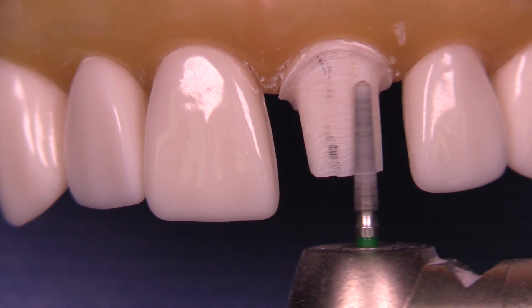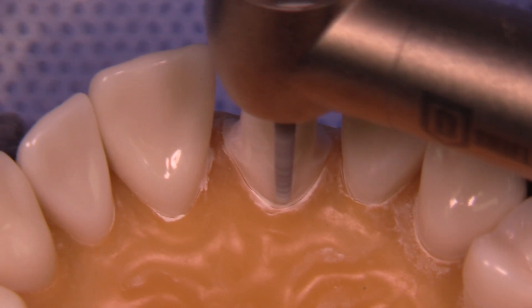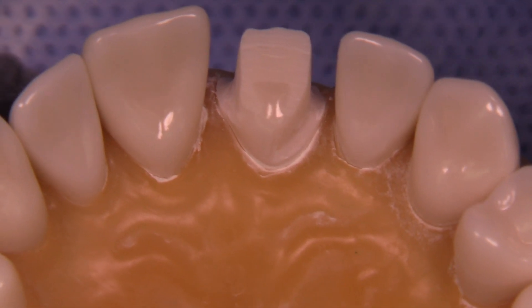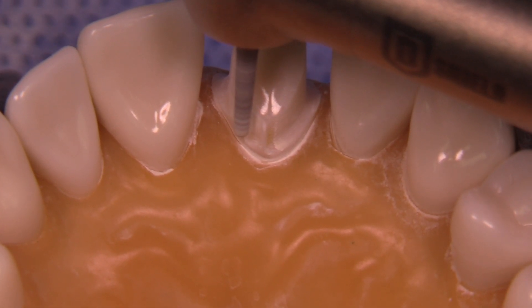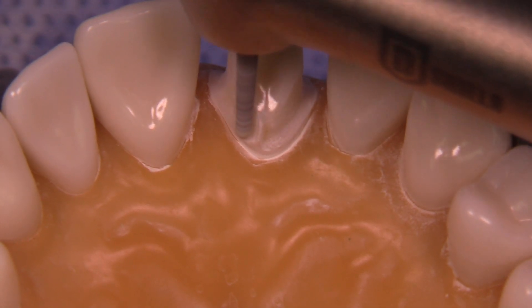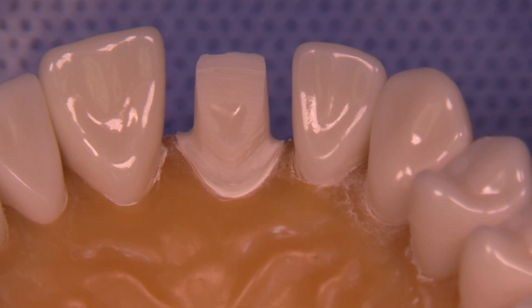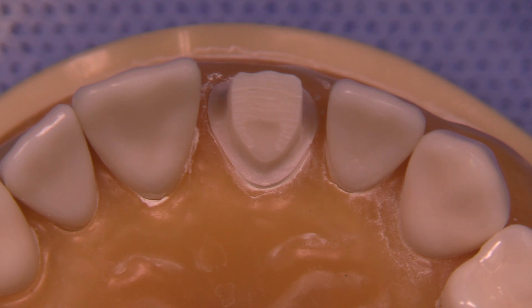At this point we're in pretty good shape for the facial preparation and we should turn attention to the lingual axial — burying the tip of the burr approximately one millimeter, keeping the burr upright and allowing the burr's taper to create the overall taper needed, working that all the way around. I know many of you are thinking this looks easy on the bench top but it's harder in the mouth. Actually I think it's easier to have the mannequin holding the typodont and use the mirror to make these preparations.